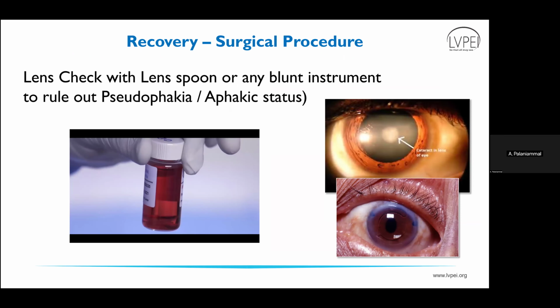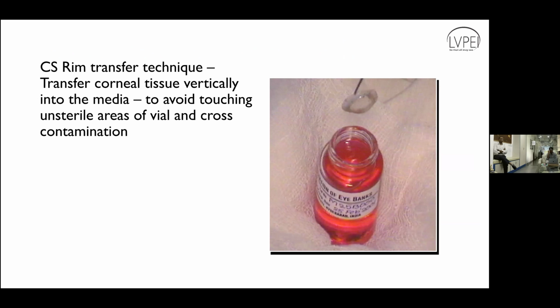While transferring, also make sure to avoid touching the margins, the edges of the vial, with the cornea. Straight away, vertically we have to hold, and straight away we have to put it inside the media.